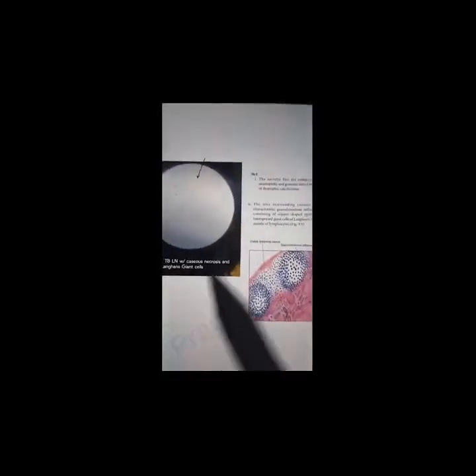Next we have is a TB lymph node. We will explain it in a more manual manner. So this is basically the diagram. Here you see a necrotic foci which consists of a structureless eosinophilic material which contains foci of dystrophic calcification.